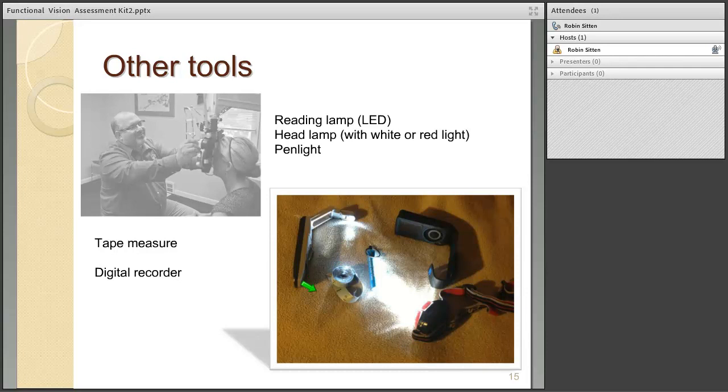Most fabric store tape measures like this are about 2 yards, which are easily managed, and it rolls up to about the size of a quarter. Also pictured right here is a digital recording device, which I happen to have from description work. It's a good tool for those who need to record notes quickly as they move to their next client.